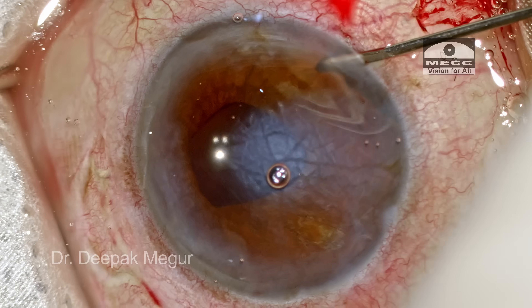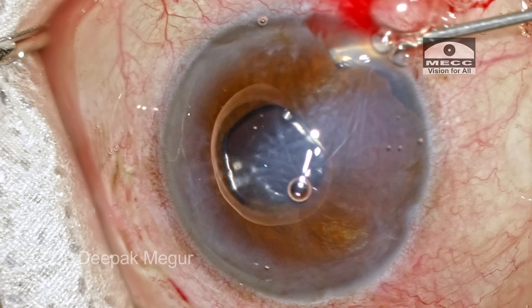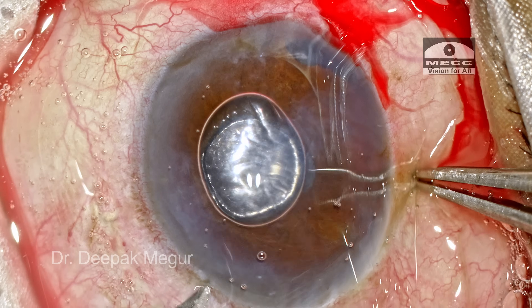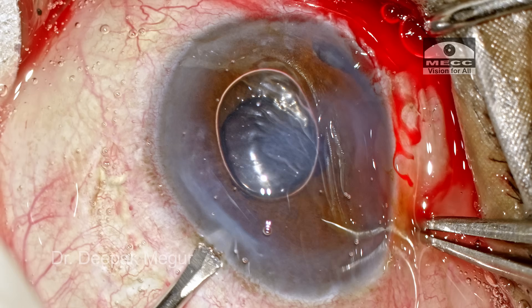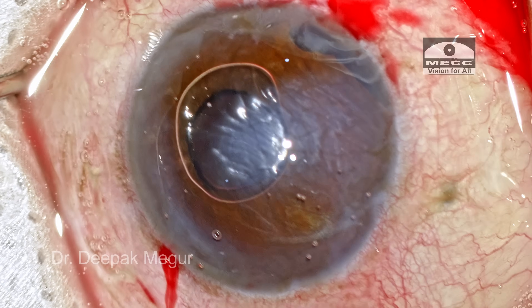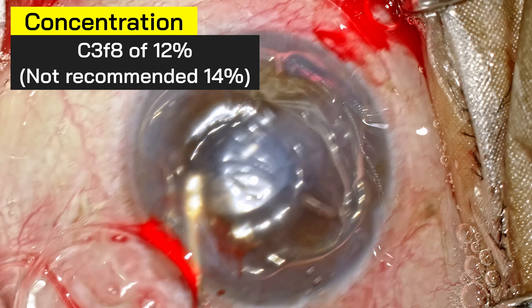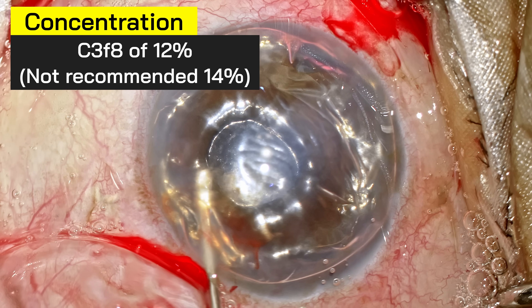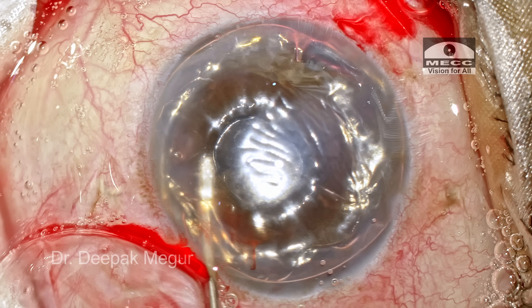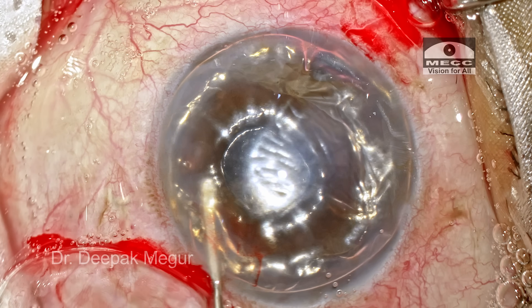Should I fill the gas through the same incision? I'm trying to do that but unfortunately I'm unable to pass the cannula because it's going underneath the iridectomy and the AC becomes flat. So I need to make another incision for the introduction of the gas. I could introduce the gas directly with a syringe and needle without making an incision, but I find it always comes out. The concentration I'm going to use for C3F8 is 12% and not the recommended 14%, because I find that even 14% — supposedly non-expansile — sometimes causes the gas bubble to expand. To be on the safer side, I'm using 12% C3F8 gas here.